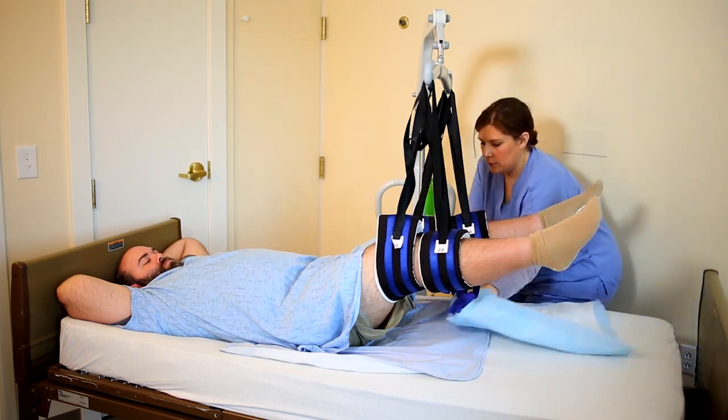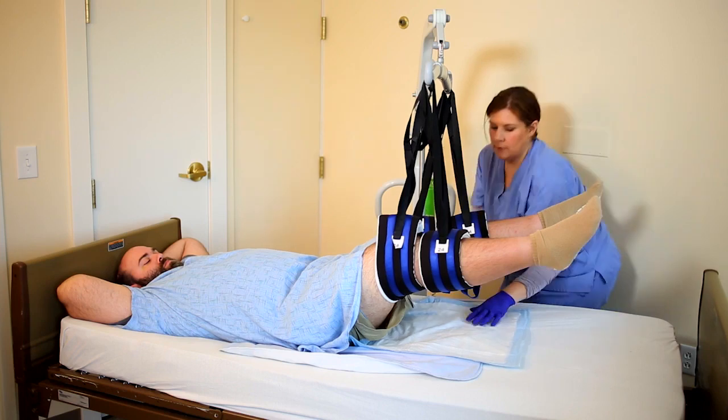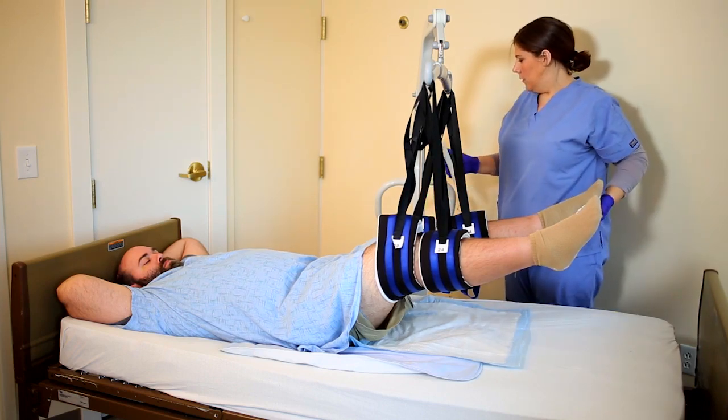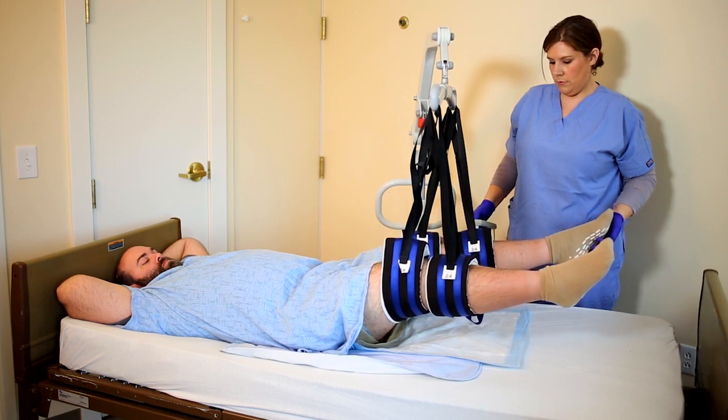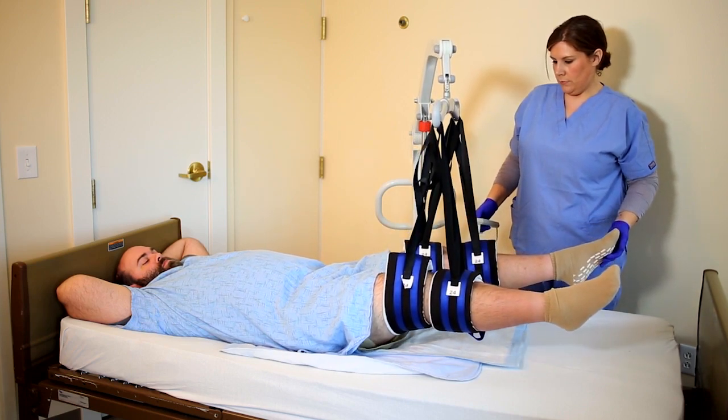The patient being suspended should not be kept up longer than required for the prescribed treatment. Lavin lift straps should never be used for transport or restraint.